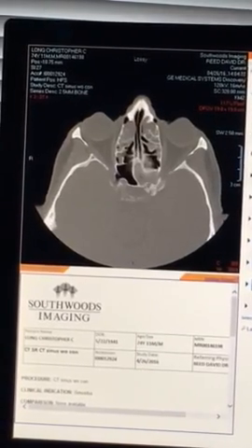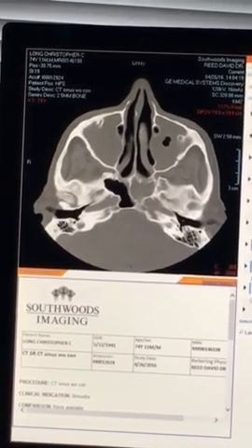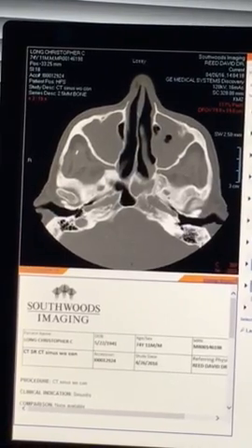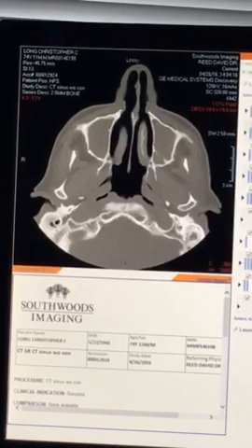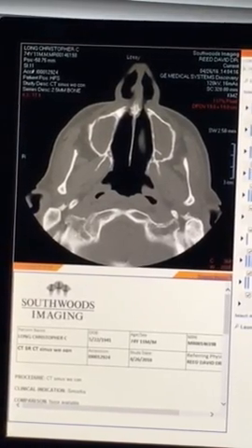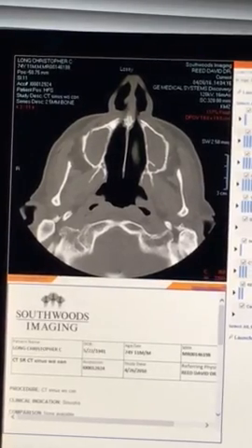We'll go up and down over a time or two so that you can see how it. There's turbinate coming in there. That's the second lower one. You see your nasal passage here in the front's clear. That's what I'm seeing when I look back there.